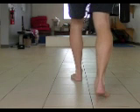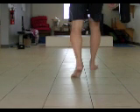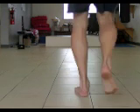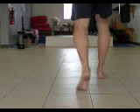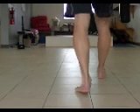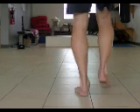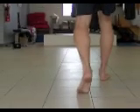Note that the toes are visible laterally just after heel off. The calcaneum flicks medially and then moves forward but doesn't really shift laterally or re-supinate. Also note the pressure on the great toe, or the first MTP joint, at push-off. The foot is angulated.